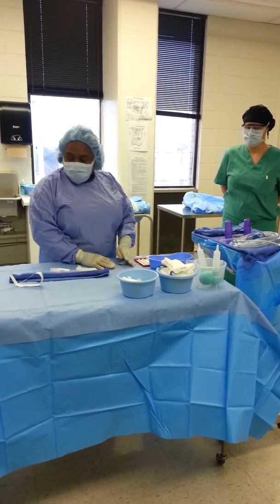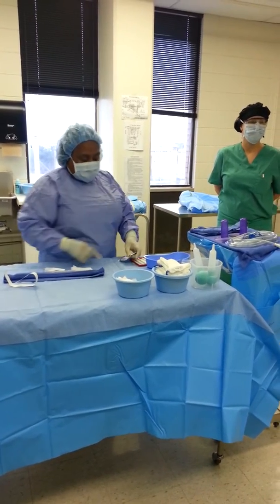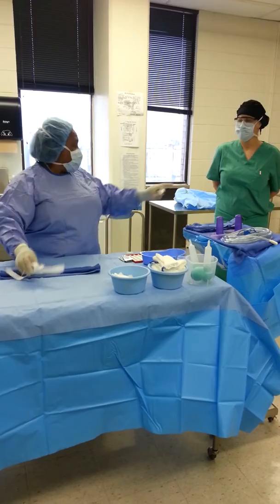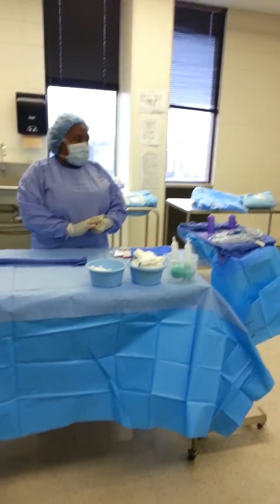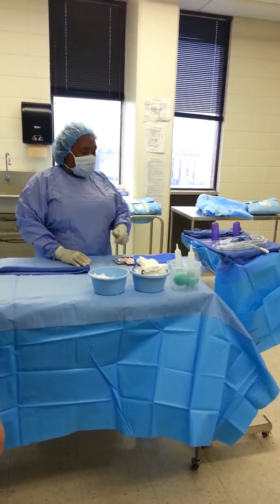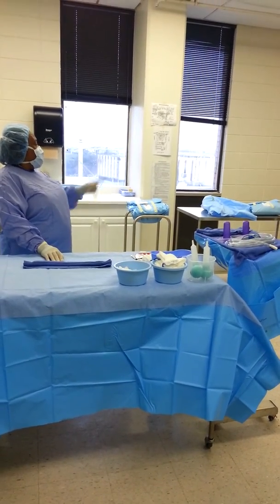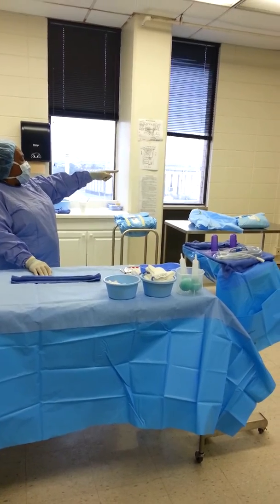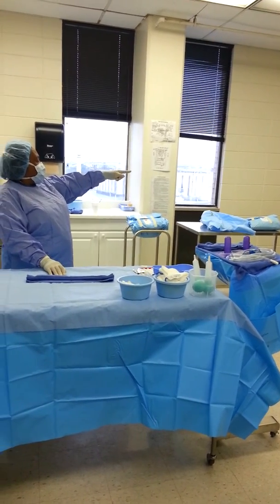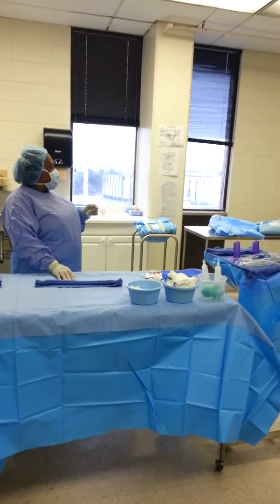Now I need one of you to be a surgeon. Who has their mask on? Look in there, they have some gloves in that blue basin. I need you to get a pair of 8s out. I need you to wet your hands. Look up there on the top, on the second shelf, at eye level, on the other side of the boxes. See that wrapper? Yeah, take those out.